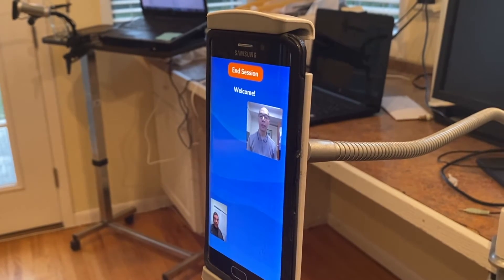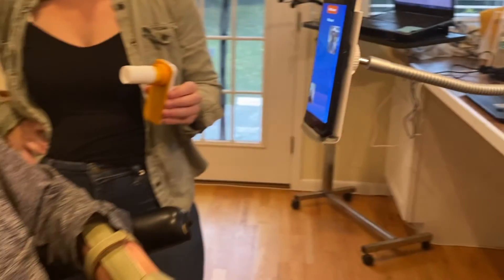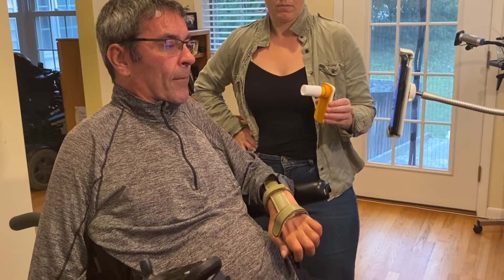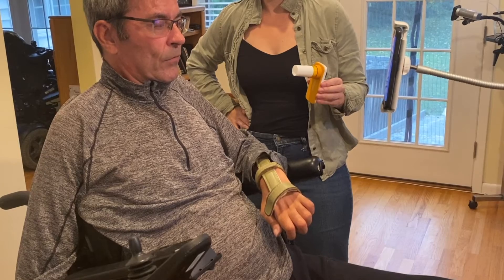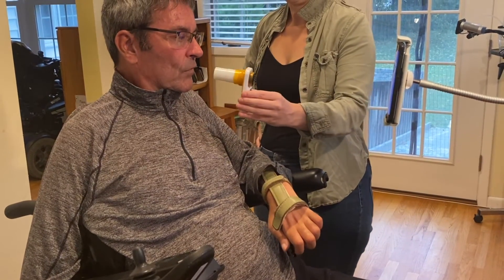I'd like you to take some normal breaths to get you going — maybe take three or four. Nothing big, just regular in and out. And when you're ready, go ahead and put the spirometer in your mouth and take a big inhale.